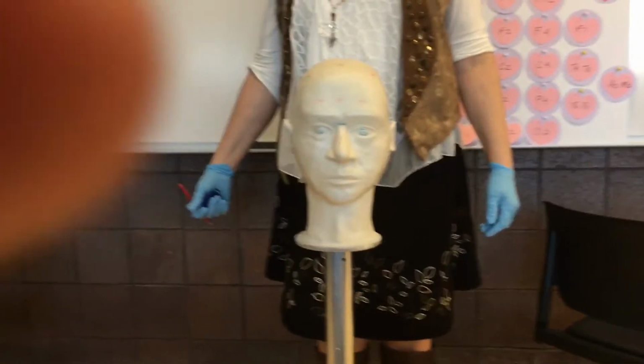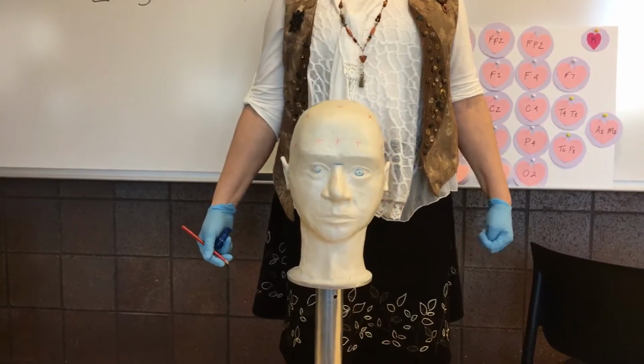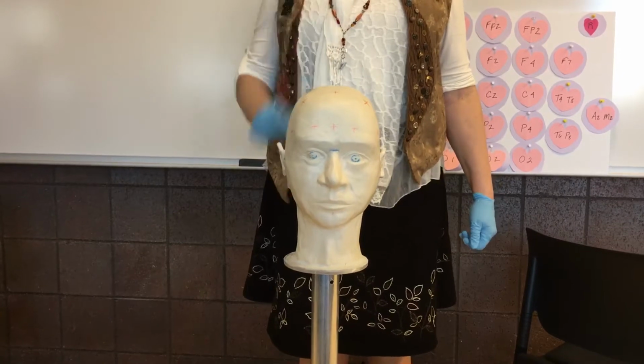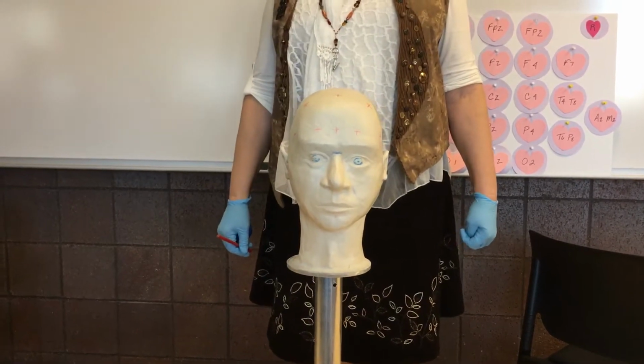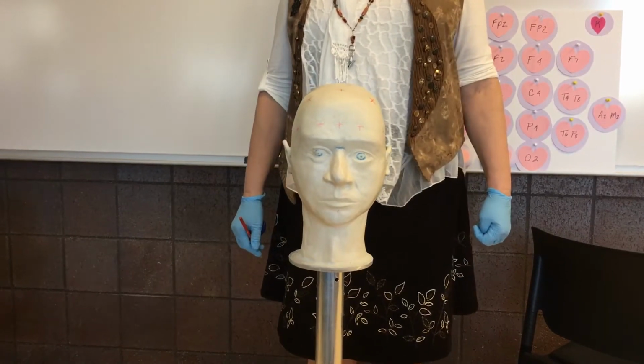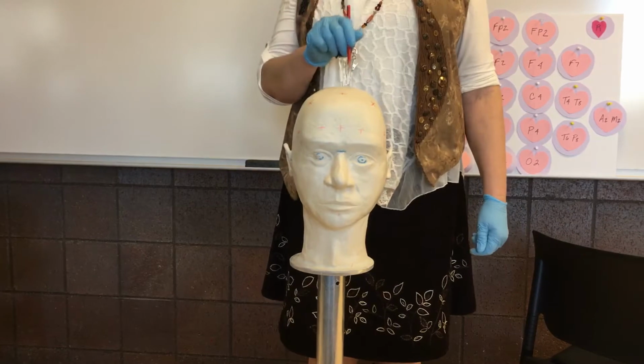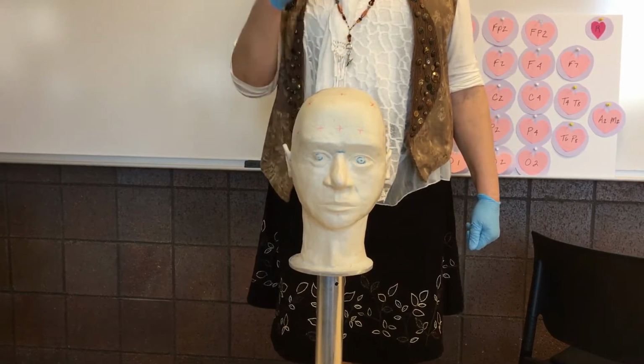She's a lot quicker than 16 minutes. I could probably do a whole head in 16 minutes if I had to. That's with putting electrodes on too. If it was stat in the ICU on a patient that's seizing, you get pretty darn quick at it. But you only get quick at it if you use this methodology.